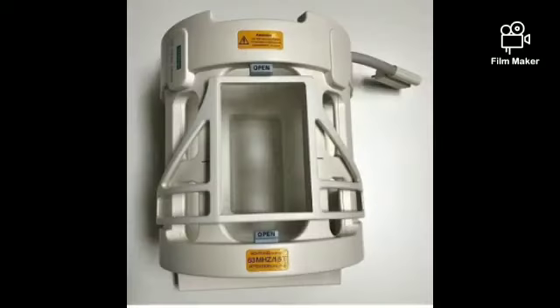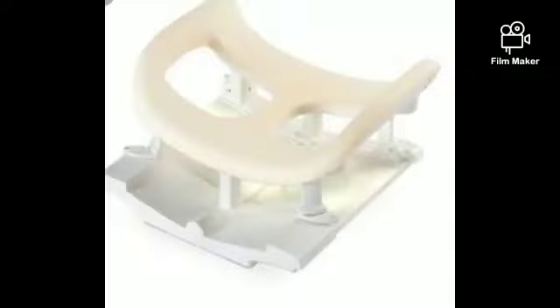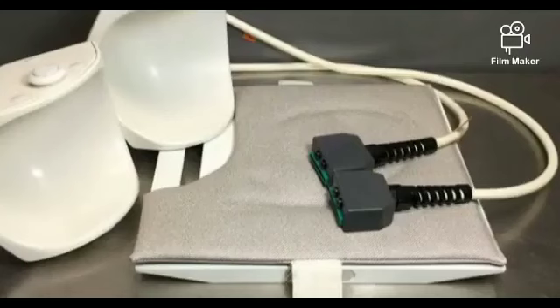So you can see here, these are the various types of head coils, and they are a type of volume coil. They have larger surface area coverage, and they are mainly used for MRI brain studies. Next, these are the types of mammography coil, a saddle type of coil, and they are also a category of volume coil. These mammography coils are mainly used for MRI mammogram studies, and in this study the patient is placed in prone position.